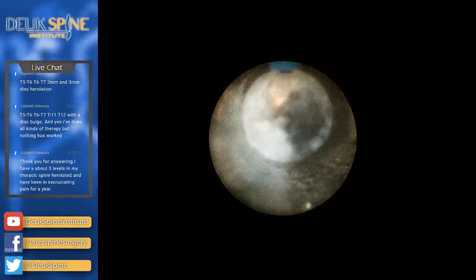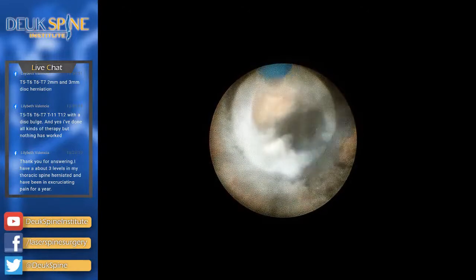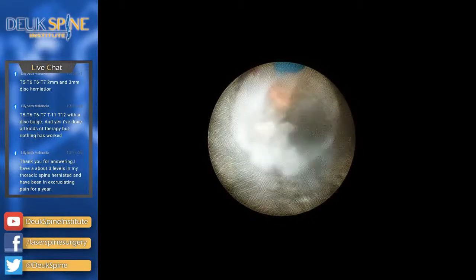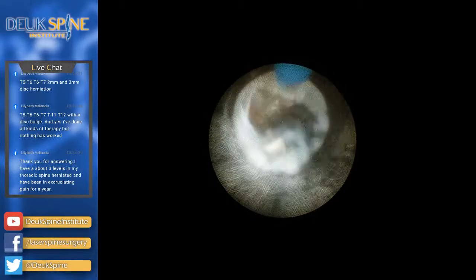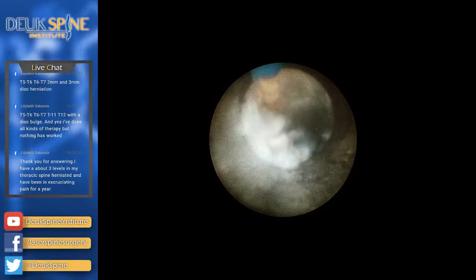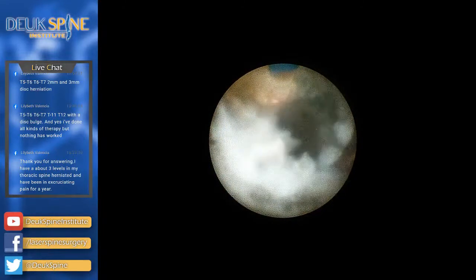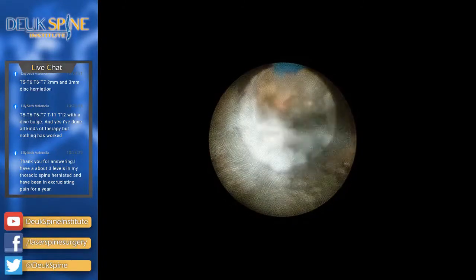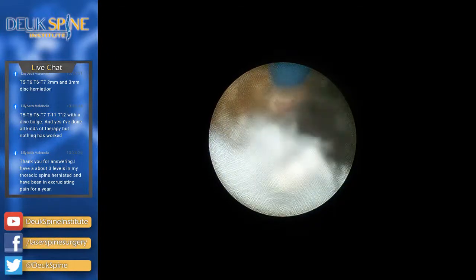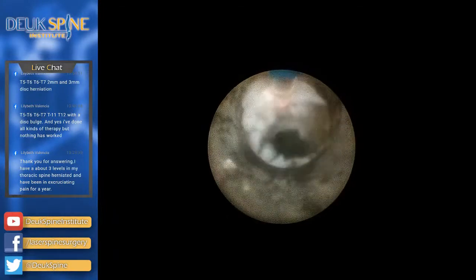The spinal cord is over there, just past the tube. And this is so scarred right here. You see all this? Incredible. We're right at the apex of the herniation. Those are fibers right there, the fibers of the posterior longitudinal ligament, very scarred up. The spinal cord is just a millimeter or two beyond that at the roof. And this is just a mess.